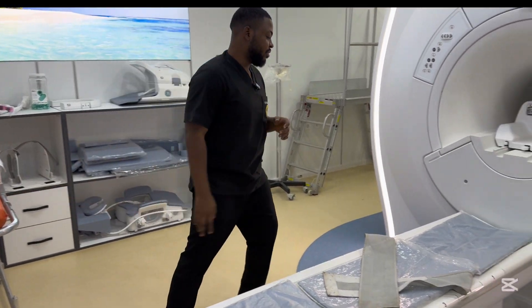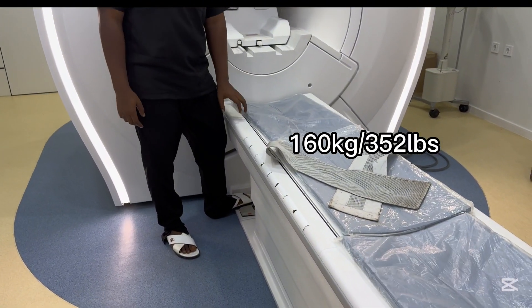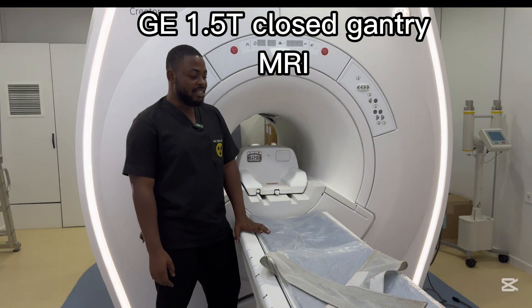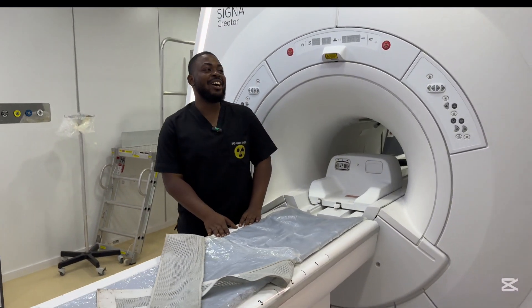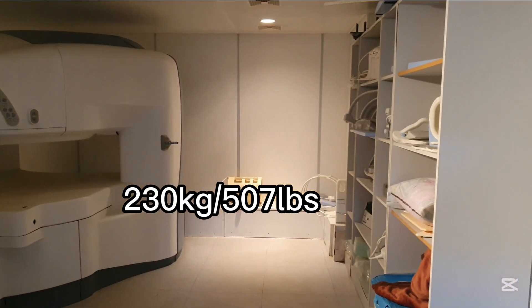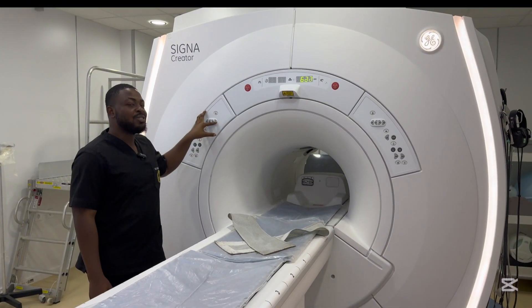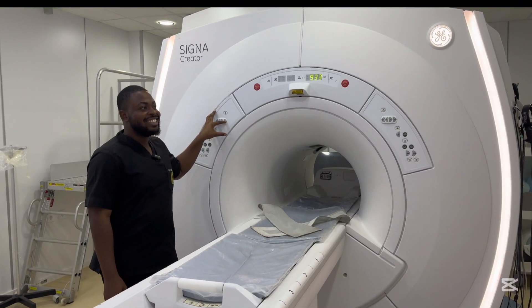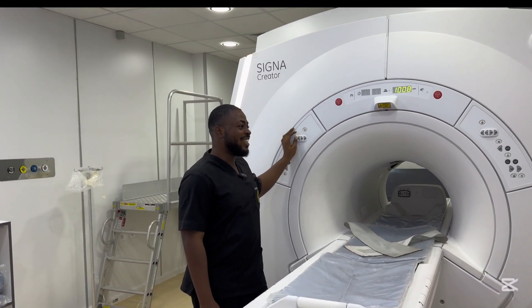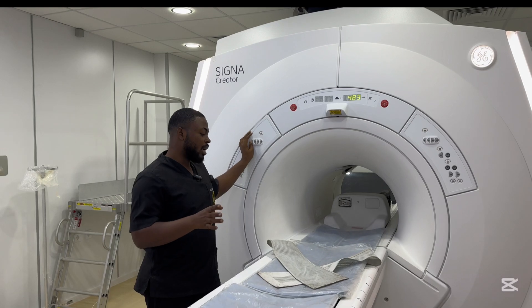This 1.5 Tesla MRI couch can actually be elevated and has a weight limit of around 160 kg. If the patient is above that weight it won't go up — the patient would have to lose weight, or we have to use the open gantry which has a higher weight limit of around 230 kg. Patients who are claustrophobic will feel more comfortable in the 0.35 open gantry compared to this very tight 1.5 Tesla. Most patients don't really cooperate during examinations in the 1.5 because of claustrophobia, so we end up using the 0.35.